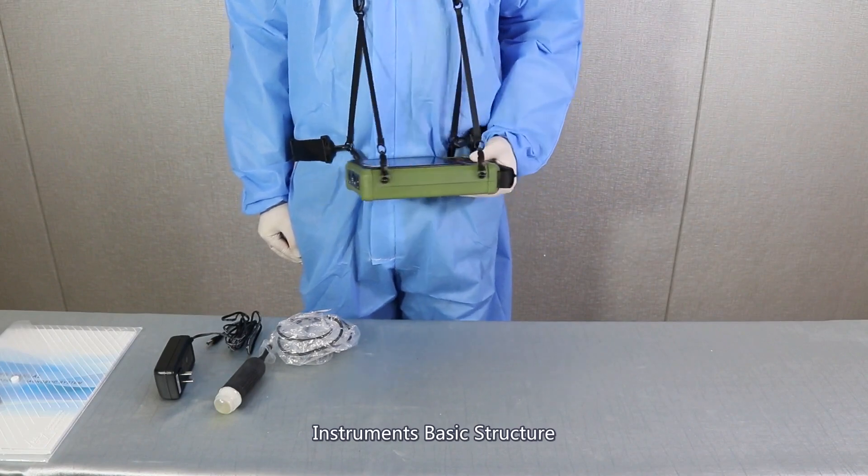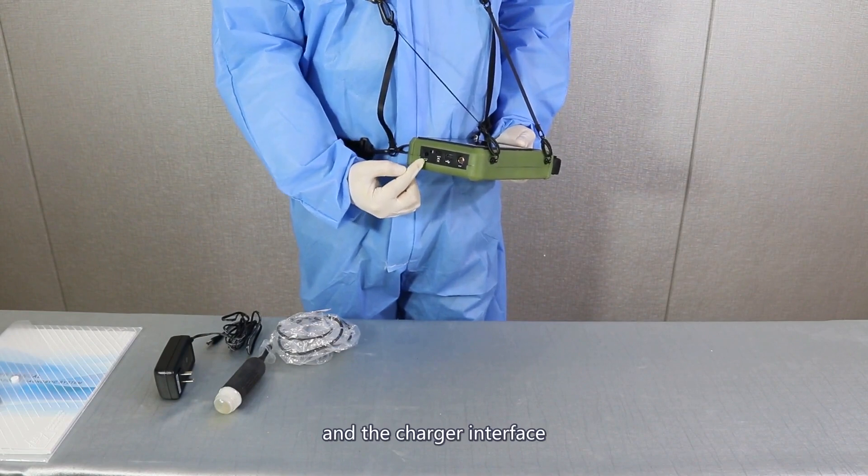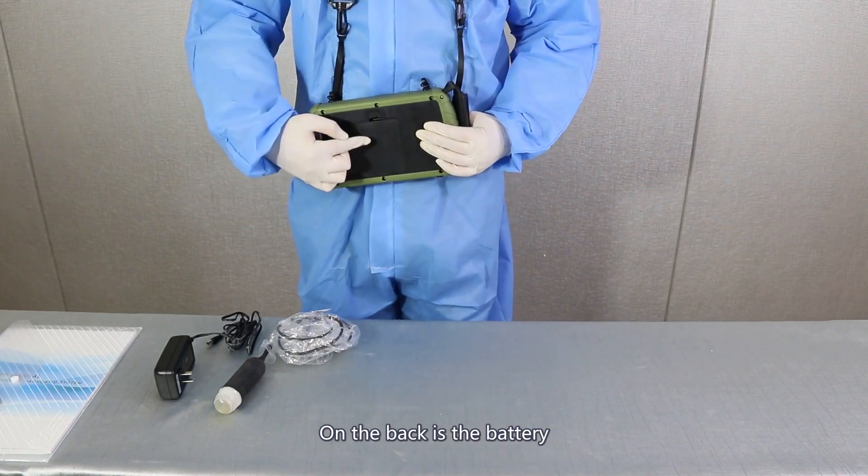Instrument basic structure. On the left is a probe interface, USB port, TF port, and the charger interface. On the back is a battery.